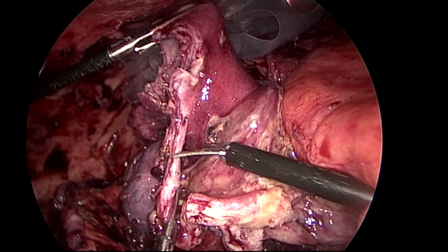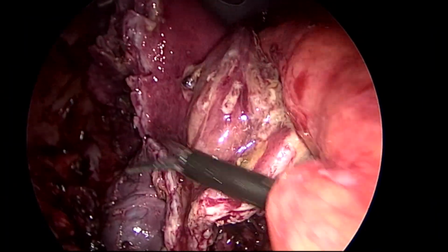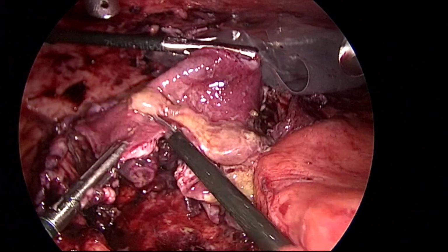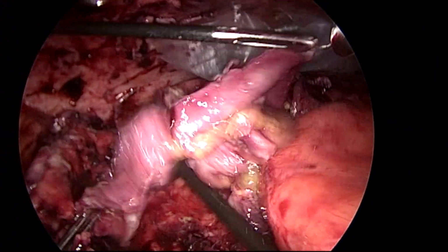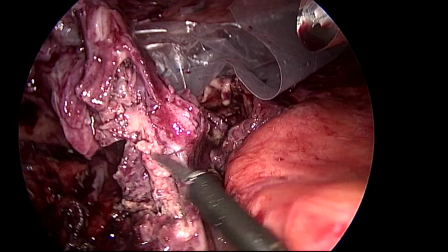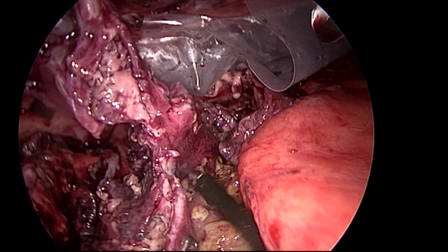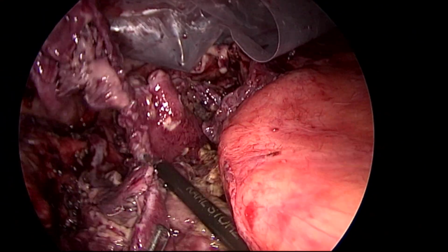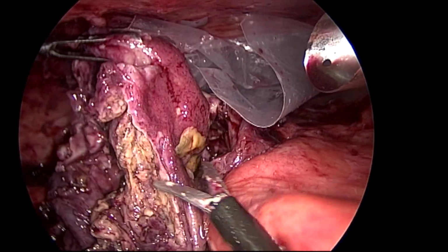Otherwise, it will not come through the 10 millimeter port. So here there is no space. So I'm dividing the gallbladder wall. You can see the very dilated, thick-walled gallbladder. So I'm dividing it into multiple pieces, around 4-5 pieces, and then I place them into the endo bag. I'll take it through the epigastric port. Since I placed it into the endo bag, I'm taking it out, so the epigastric port will not get infected.